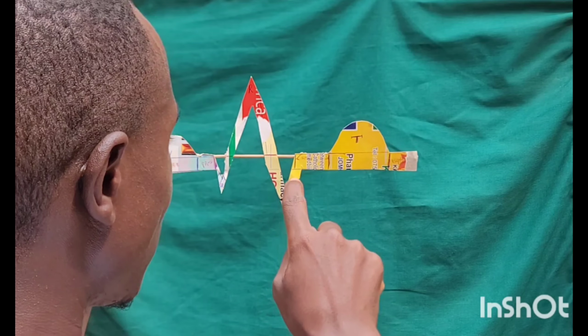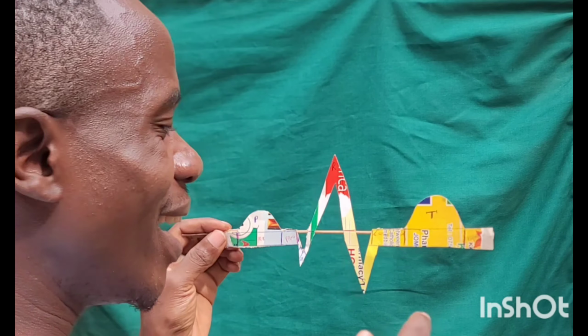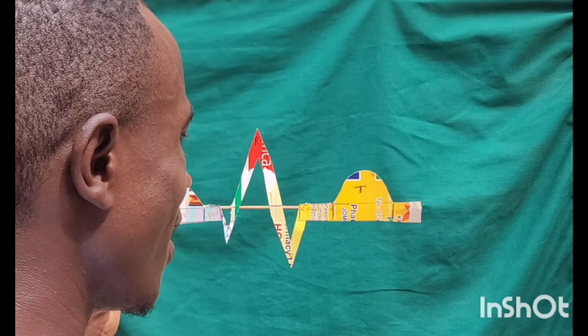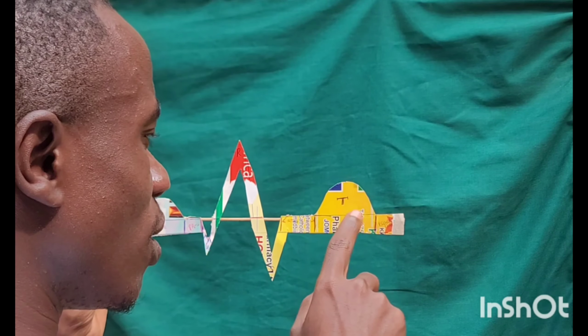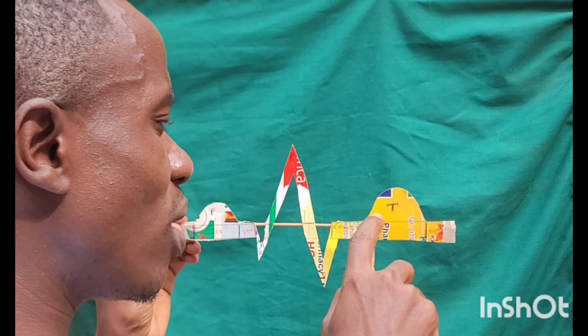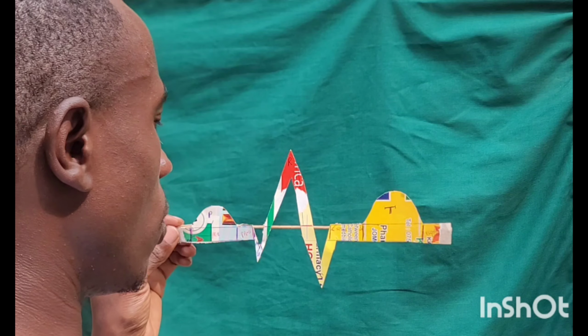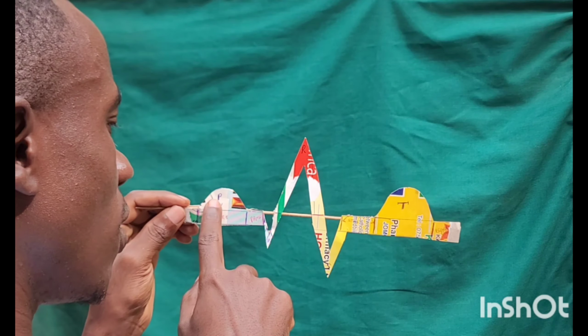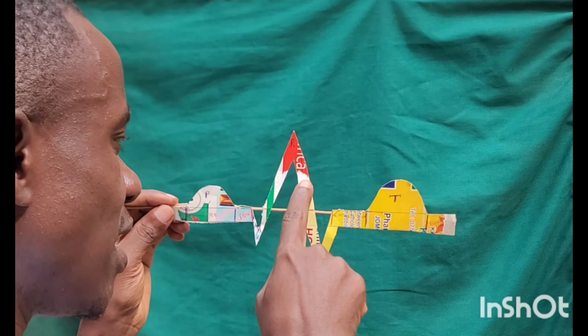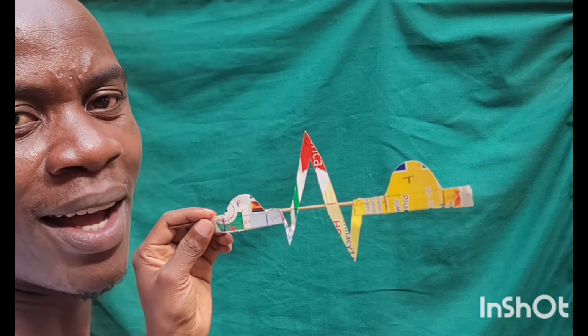And then this S wave, which was a negative deflection, was denoting what we call the depolarization of the base of the ventricles, what you call the basoventricular depolarization. Okay, and it was a negative deflection. And then the last wave, this one here, was denoting what you call ventricular repolarization. Okay, and this one was a positive deflection, which meant ventricular repolarization. Okay, so now this is atrial depolarization, septal depolarization, major ventricular depolarization, basoventricular depolarization, and then ventricular repolarization.